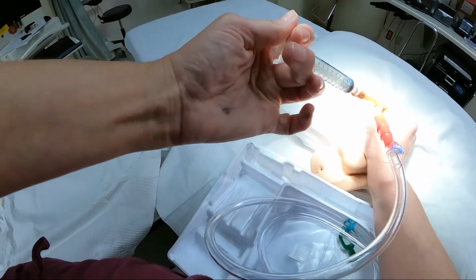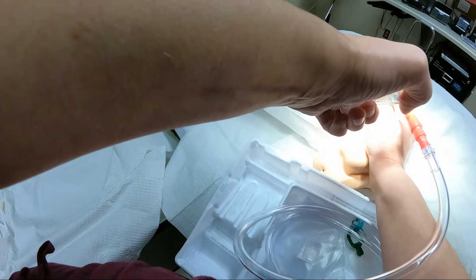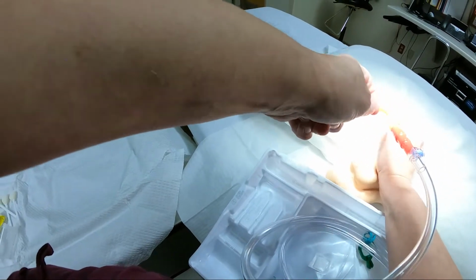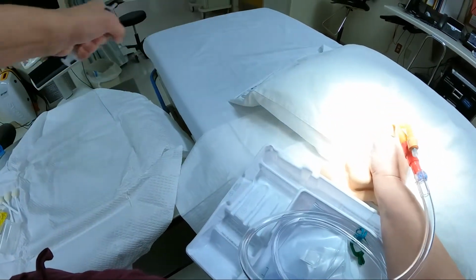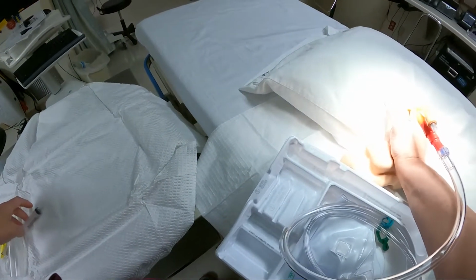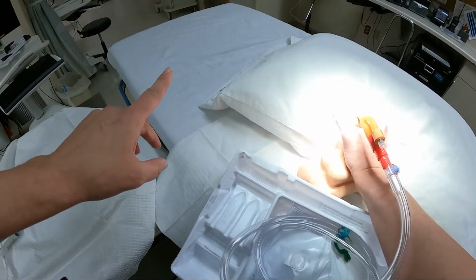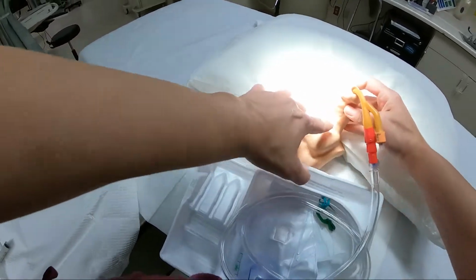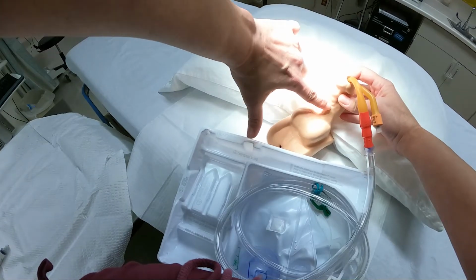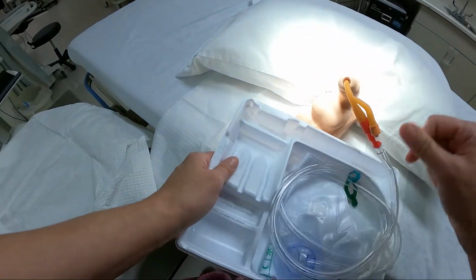Occasionally you don't, because like I said, especially if you use the Urojet and you put a lot of lubricant down in the urethra before you put the catheter in, it's going to take a little bit for the urine to start flowing through that gel. Now, once that's in there, no yelling, you're feeling right in here where you'll feel the balloon start to blow up. That's all going well, that's great.